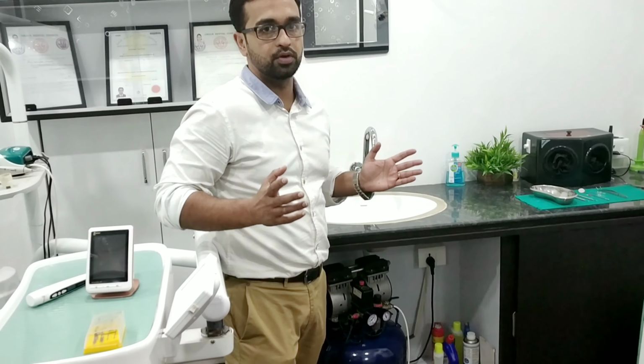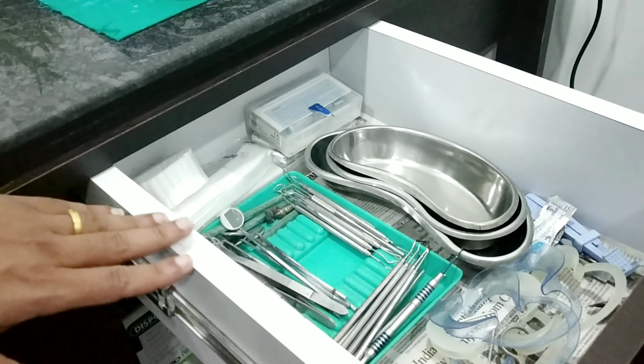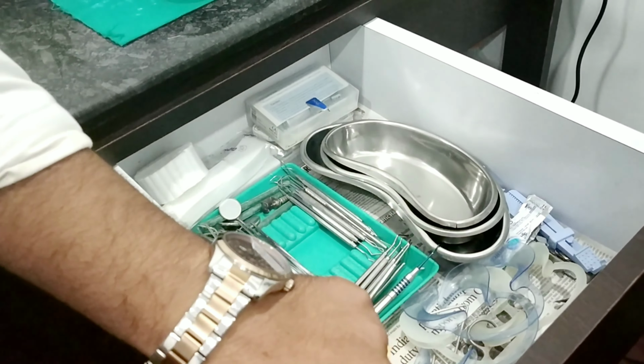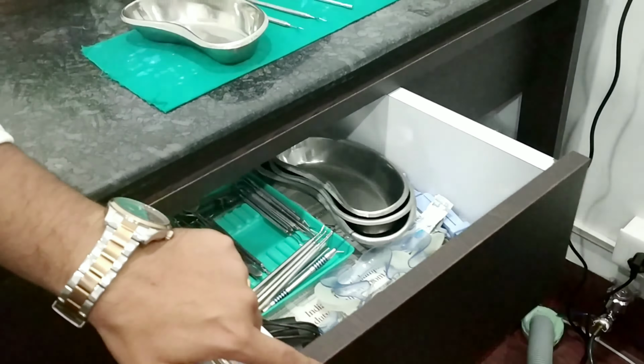And on this side I have kept all my equipments, and I have kept one drawer over here in which all my instruments are there. As you can see, it's a sliding door and it can save a lot of space. So here are all my instruments, trays. So this is the second drawer, so this will save a lot of space for you. So just one can go and access and work over here.